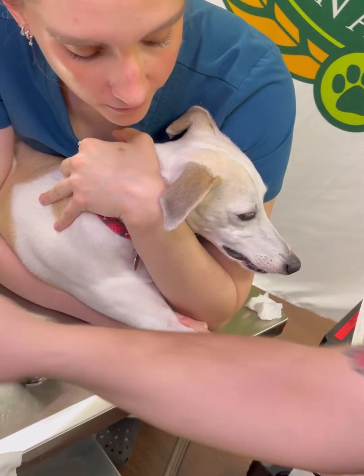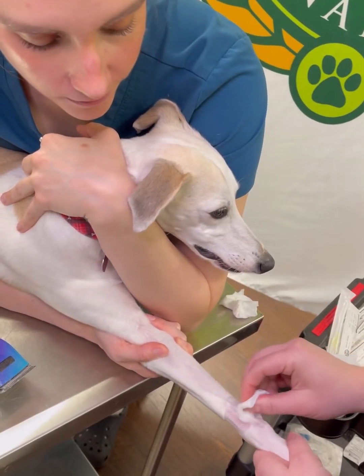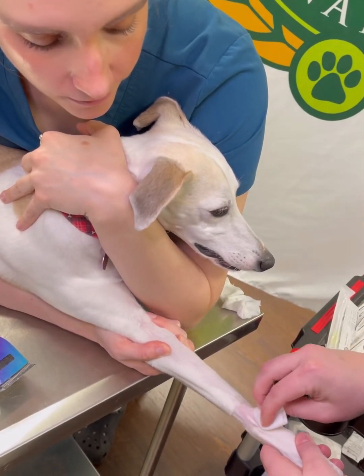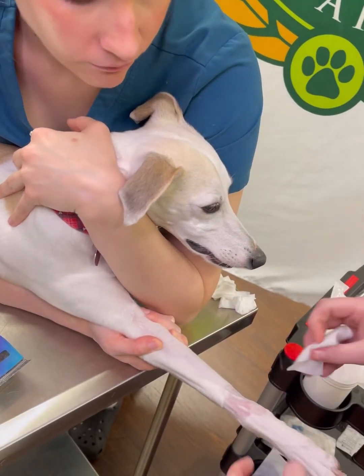We do three scrubs, and then we'll do alcohol the same way. I always start at the top, wipe down, making sure not to touch the hair above the shaved area.